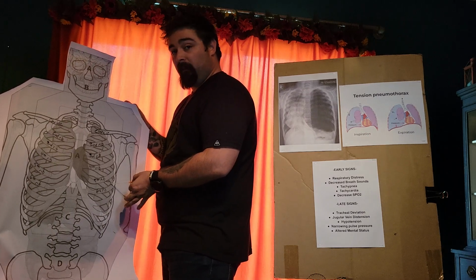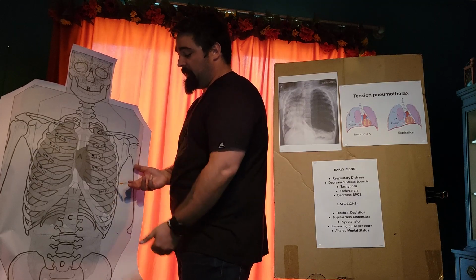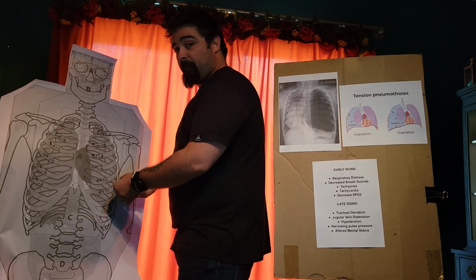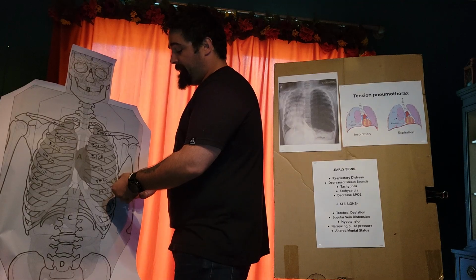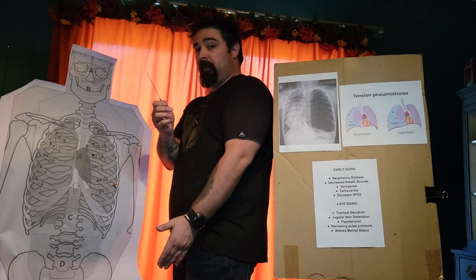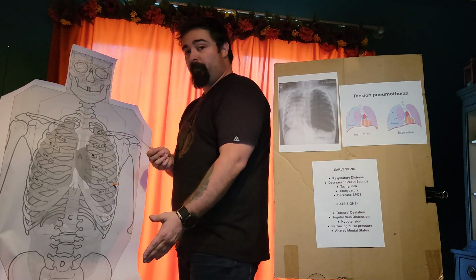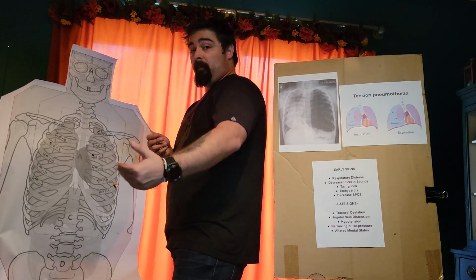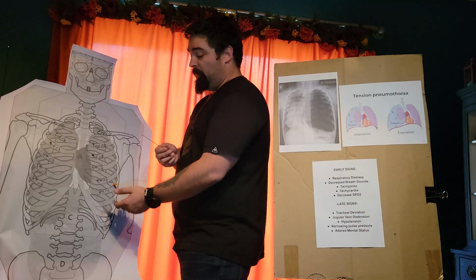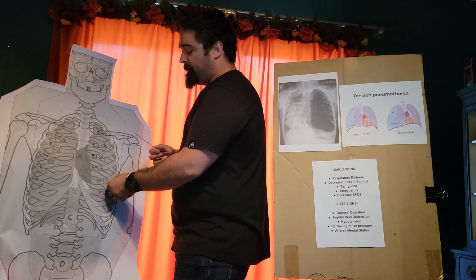You're going to advance the needle until you hear the pop, hear the hiss, see the hub flash, or get any blood return. Stopping the advancement of the needle, you're going to go ahead and advance the catheter, remove and appropriately dispose of the needle. Leaving the catheter in, letting it do its job, typically works for a couple of seconds. You'll have, again, that relief of the pressure. The lung will be able to expand typically, and you'll have that return of better respirations. Tachycardia and tachypnea are now improving.